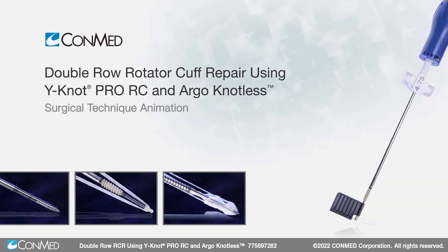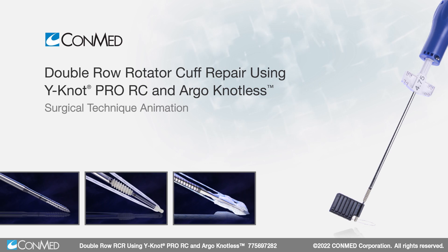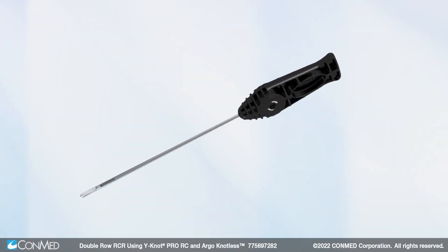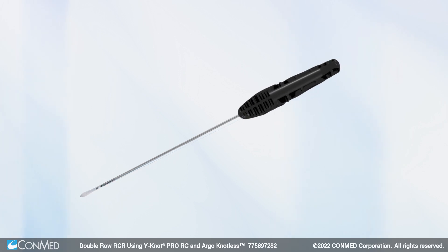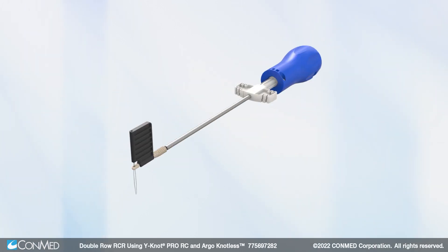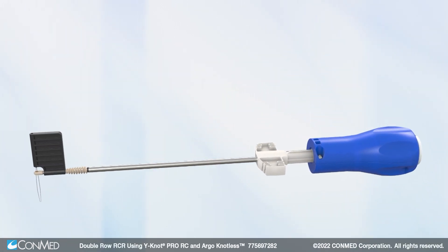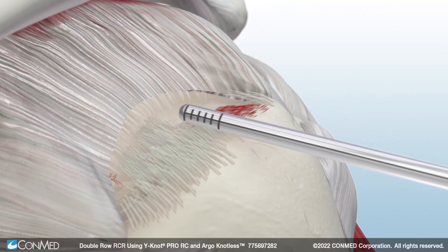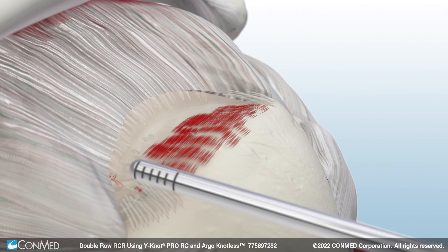This technique demonstrates an arthroscopic double row rotator cuff repair using Conmed's Y-Knot Pro RC All-Suture Anchor with Hi-Fi Ribbon and the Argo-Knotless Suture Anchor. First, prepare the footprint in the subacromial space using Conmed's Stealth Shaver Blade.